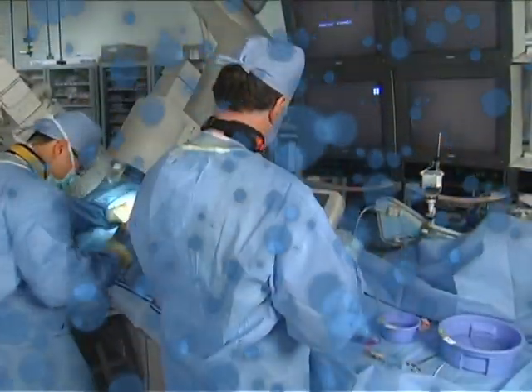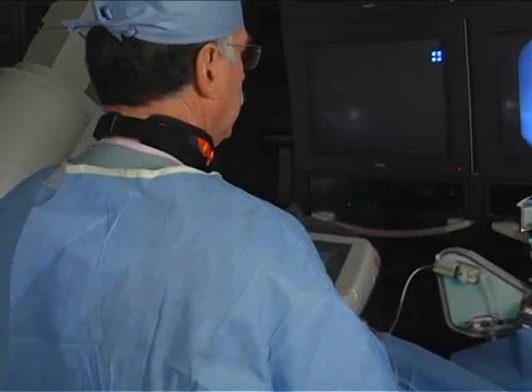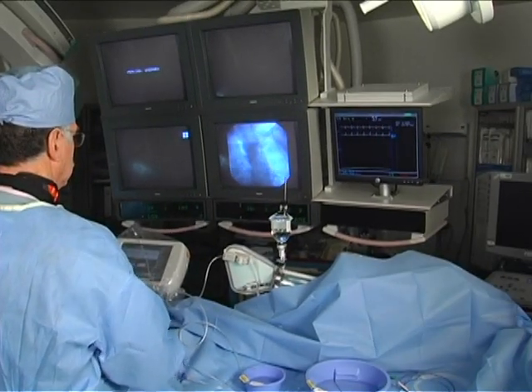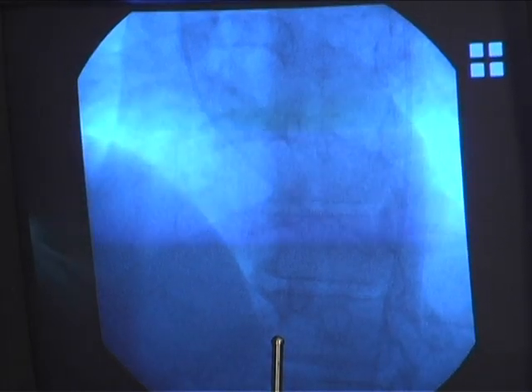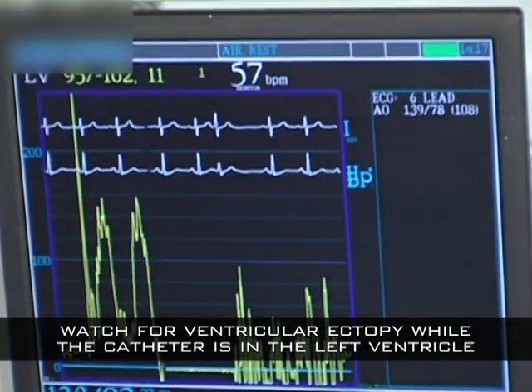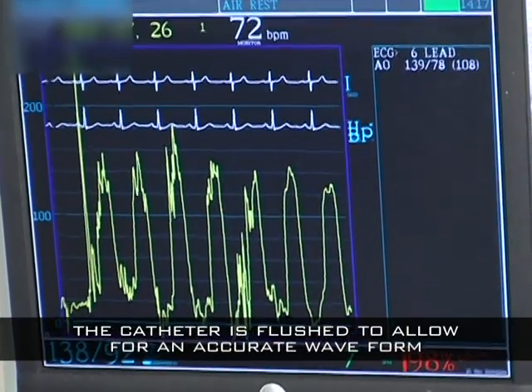Okay, our pigtail catheter is going up. Yes, please. Okay, Russell, 9 tubes, follow us around. Go ahead, Will. Okay, push over. Take it right in. Got the wire too if you need the wire. You're there, you're there. Okay, watch your rhythm. Okay, here's your hookup. You said ATW wire? ATW is fine. And I need to know when the angiomax is on its way. Okay, thank you.